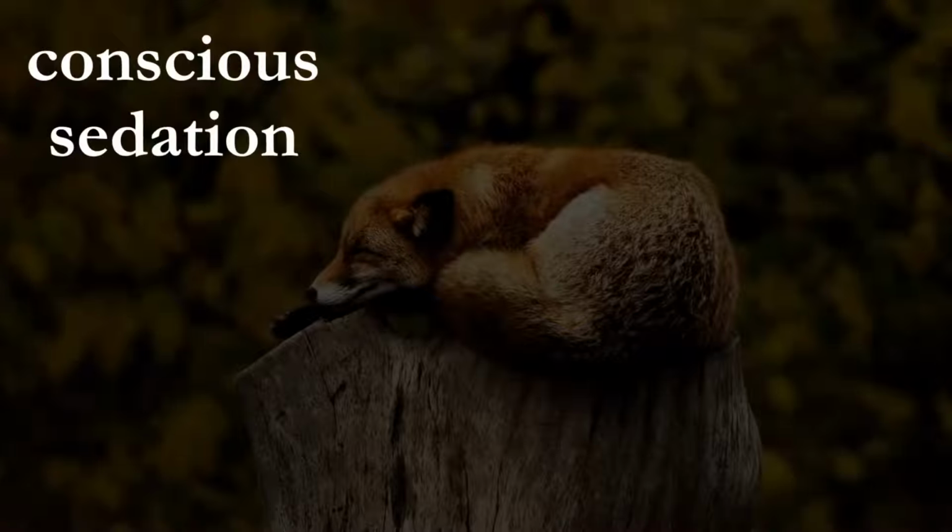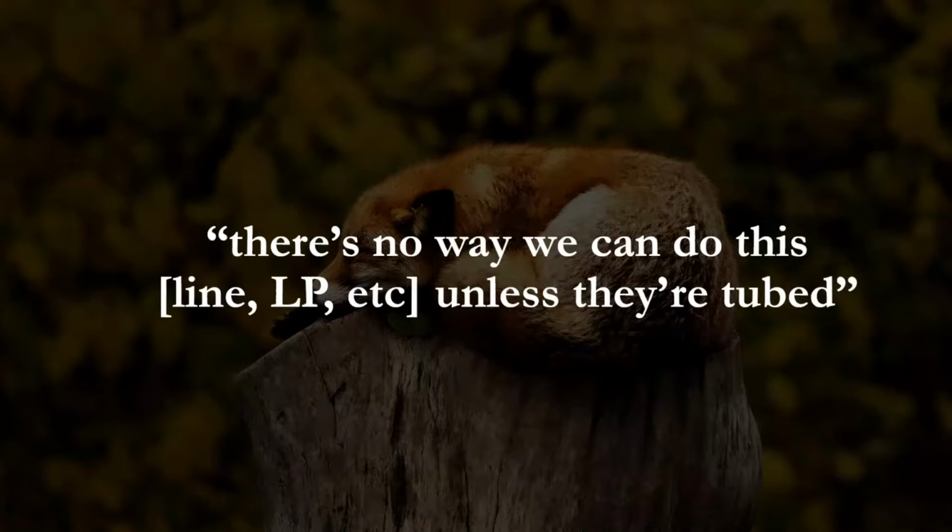Another application that's widely accepted for waveform capnography is conscious sedation. This is a much easier way to detect airway obstruction and hypoventilation minutes before your pulse ox will change. Whenever I hear a phrase when I'm rounding in the unit or overnight, and a fellow will say something like, there's no way we're going to be able to do this line, this LP, whatever, unless the patient's tubed, then I start to think about doing conscious sedation with waveform capnography.